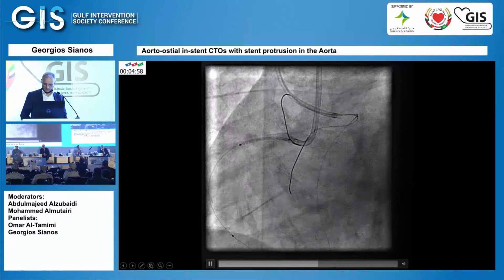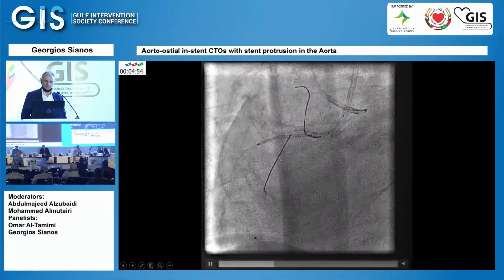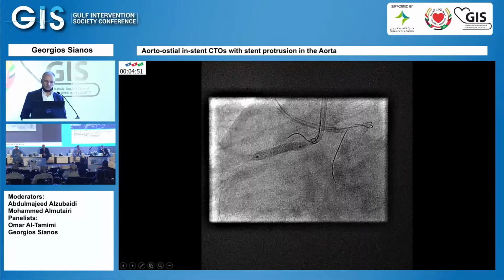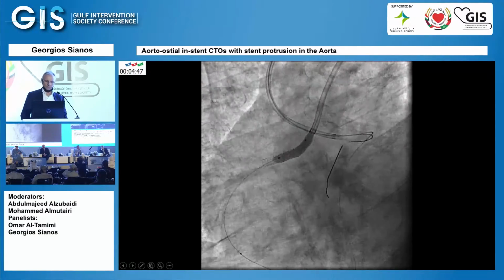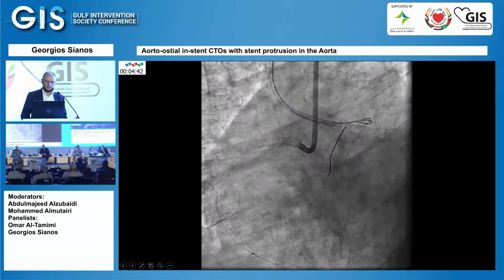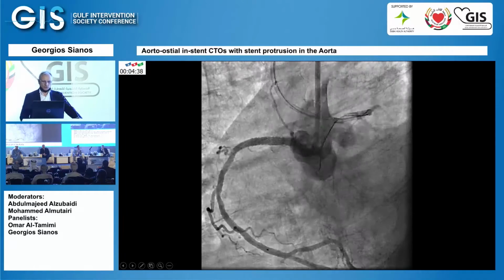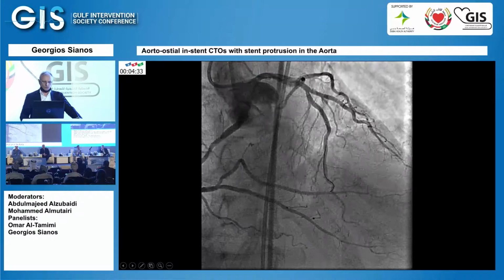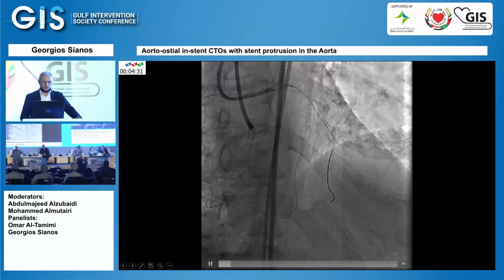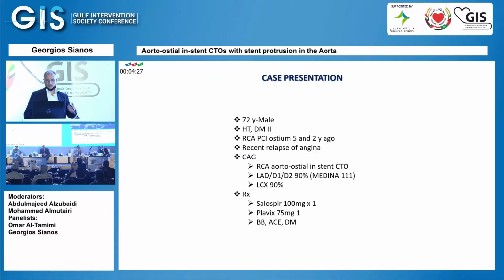away from the ostium of the right coronary artery. And then again here you see the metal, some other projections, the inflation over there. You take the balloon, the wire that was in the sinuses, and do post-dilatation with a 4.0 balloon. IVUS, which I'm not going to show you, showed a good expansion, and that's the final result here. Finally, you see there was a very dominant, big right coronary artery. The patient has benefited. So that's one case. There is a second case.